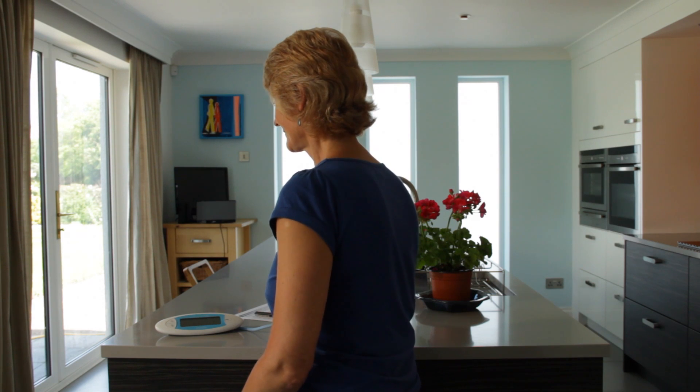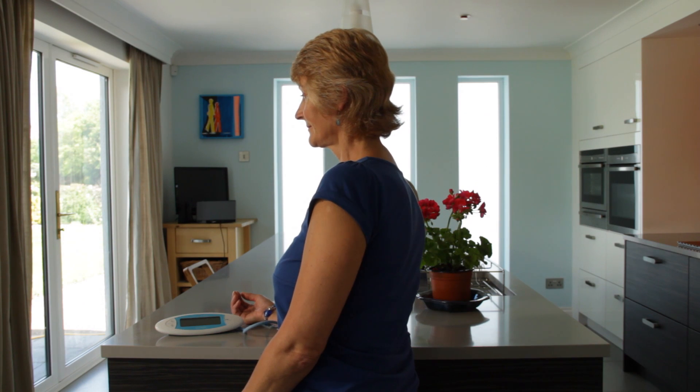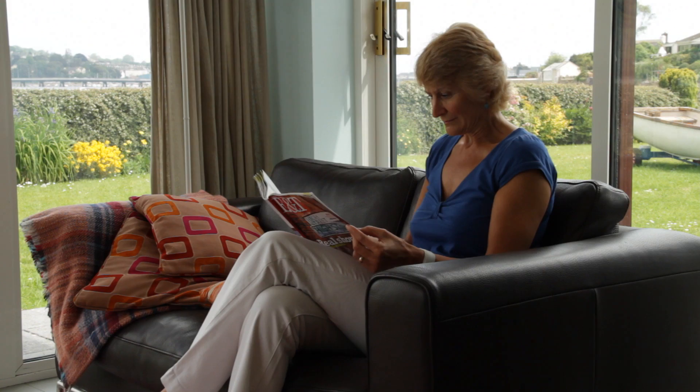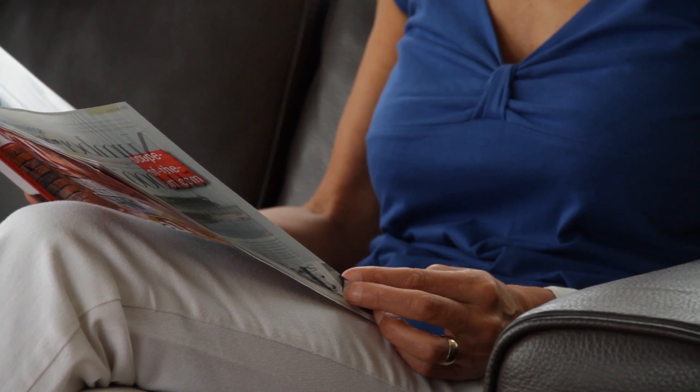Ideally, the test should be done whilst sitting upright with your back straight and your arm at the same level as your heart. For the best results, you should wear loose-fitting or short-sleeved clothing, as the cuff must be applied next to your skin.